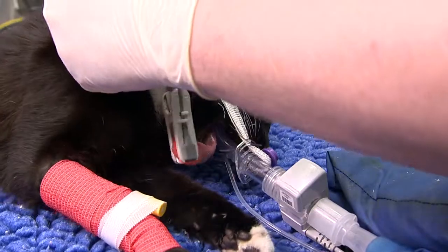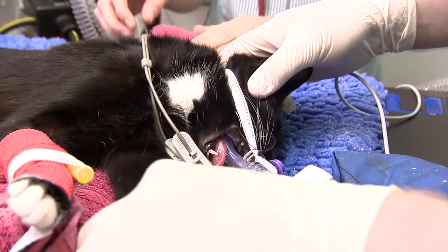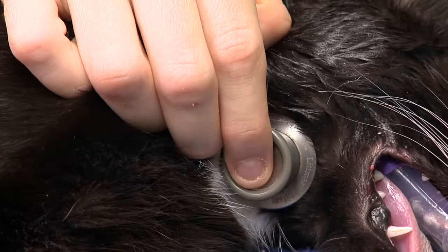Tilt the head downwards to ensure fluid runs out of the mouth. As part of the routine anaesthetic checks, the throat should be auscultated to check for fluid sounds.